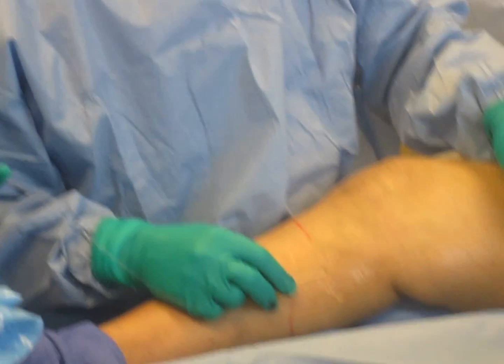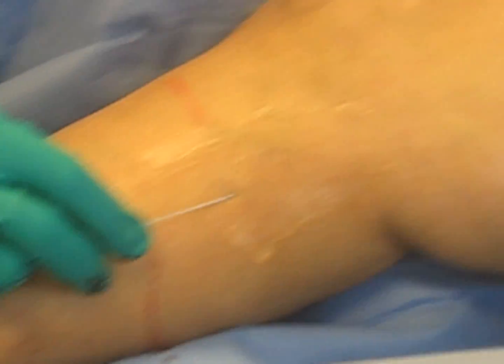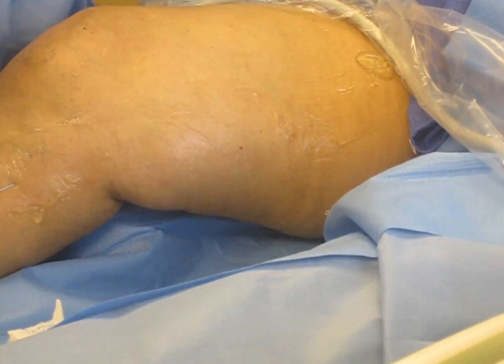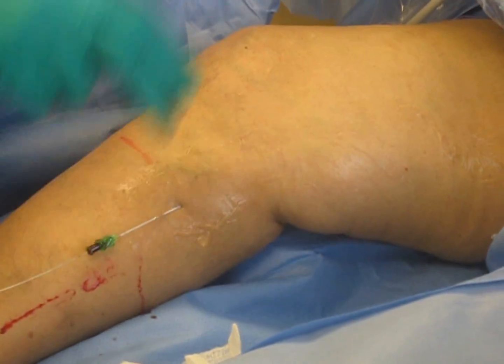We've run our guide wire up the vein and we're going to take that all the way to the top. On our screen we can see the guide wire, which is now inside the vein — that little round circle, that little bright spot there. We're going to bring it down to where the superficial vein goes into the deep vein. That is good.